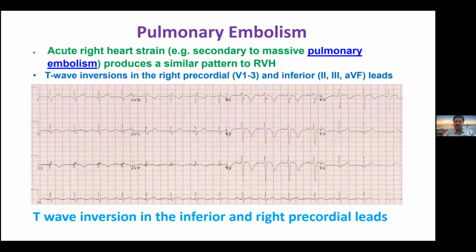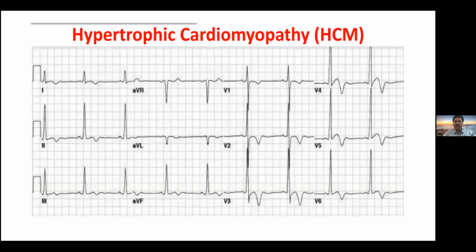In pulmonary embolism, where there is a right ventricular strain pattern, you find ST-T changes in the anterior leads, where you find ST depression. Typical tachycardia, ST depression in the anterior leads, S1Q3T3. See here, S1Q3T3, typical of pulmonary embolism. This is how a simple ECG will give a clue of pulmonary embolism in an acute breathless patient.